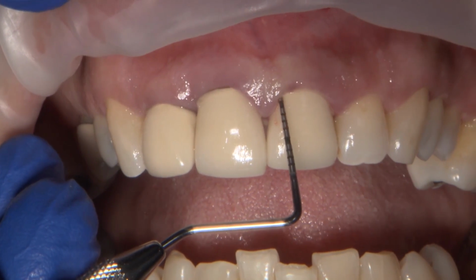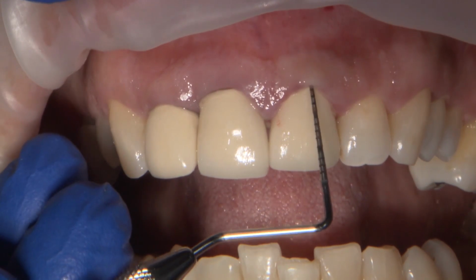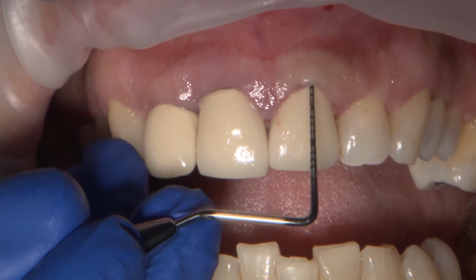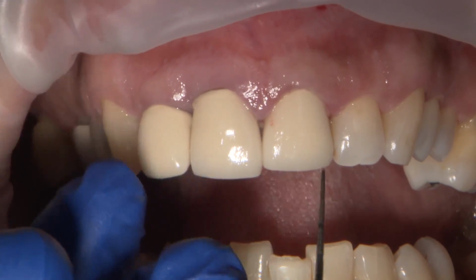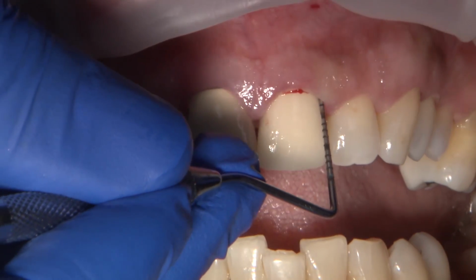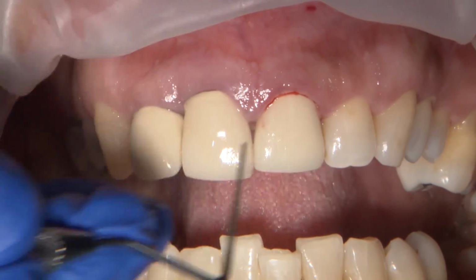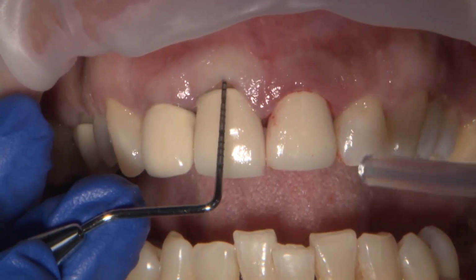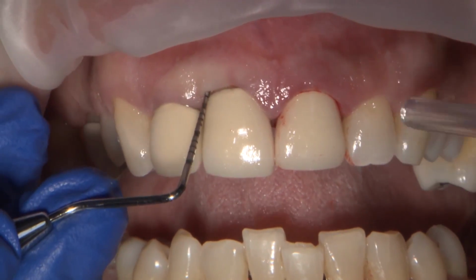I start by evaluating the gingival tissue thickness in the simplest way, using a metal periodontal probe into the sulcus. Because we know recession of periodontal tissue is more common with PFMs, and this risk increases in patients with thin biotype, this technique will help me assess the gingival biotype. It can be noted that this patient has a thick gingival biotype.